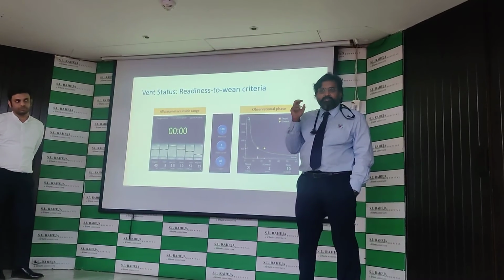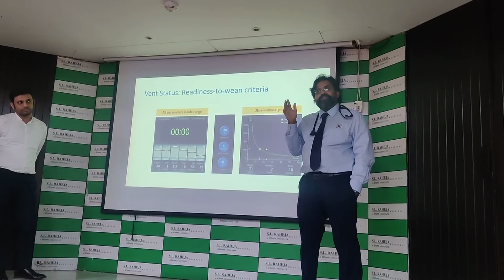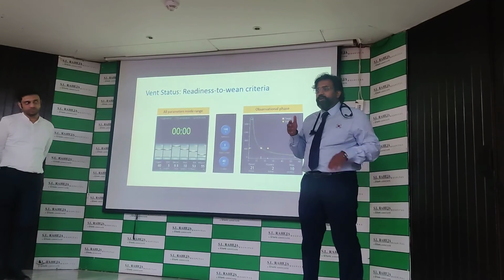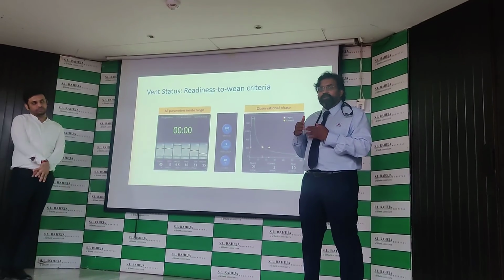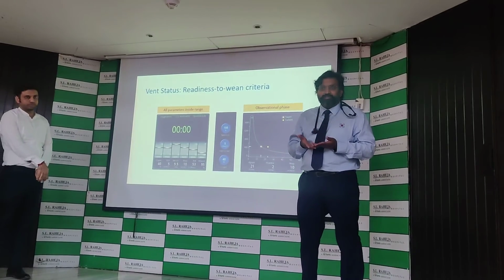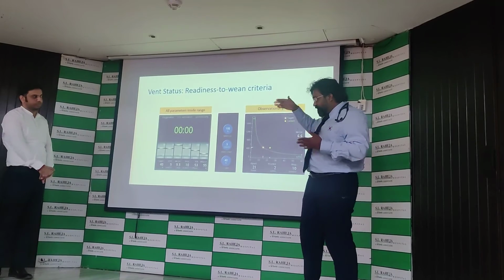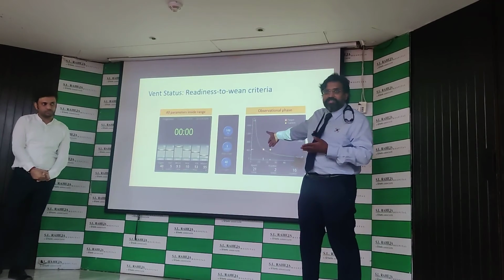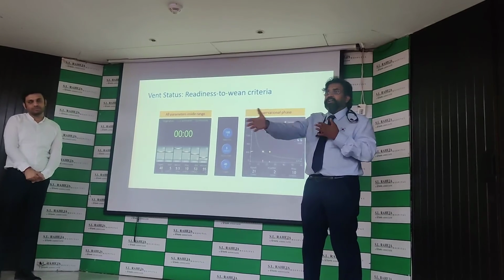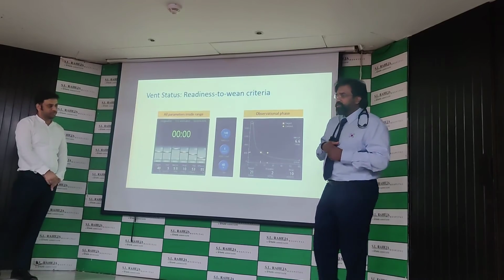If your respiratory time constant is going lower and lower, you can understand that the compliance is worsening and worsening, and that is why your RR is increasing or decreasing, depending on an obstructive or restrictive pattern. So we are looking at your expiratory time constant, which this machine is calculating. This is the only machine that is calculating this. You will have an idea why the RR is going up or down, or why the tidal volume is going up or down. You understand?